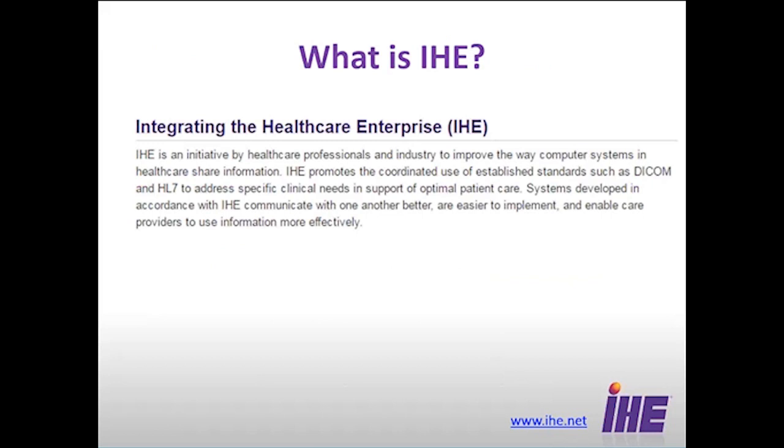And what's IHE? This is right off the IHE website. It's really an attempt to improve the interoperability for the exchange of electronic information, and it is throughout the entire healthcare enterprise. It is not specifically for radiation oncology, although what we're going to talk about today is specific to radiation oncology, but IHE is much bigger than that.